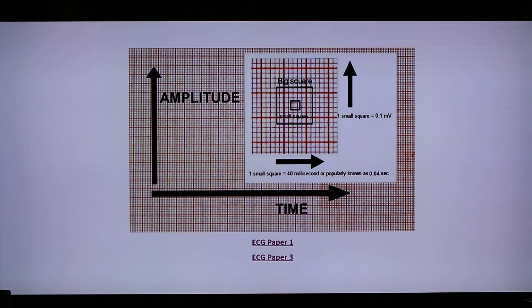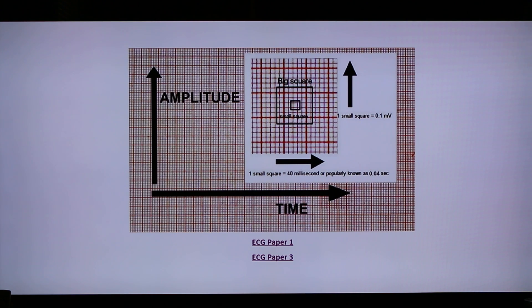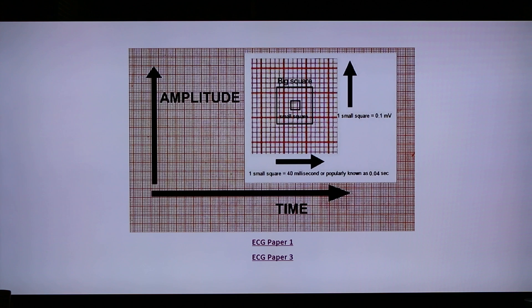So two big boxes is equivalent to 0.4 seconds. This time reference is used to measure intervals like PR interval, QT interval, and duration like QRS duration.